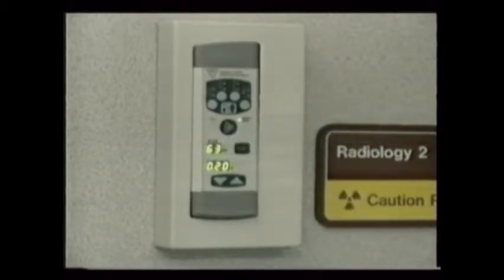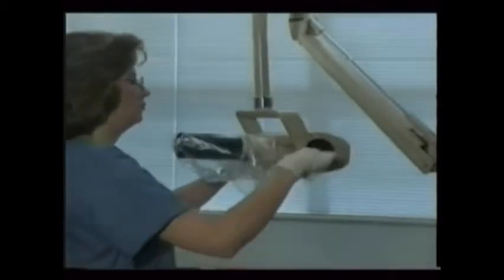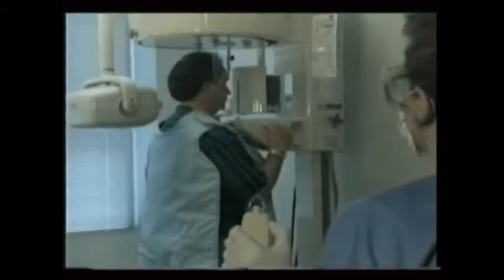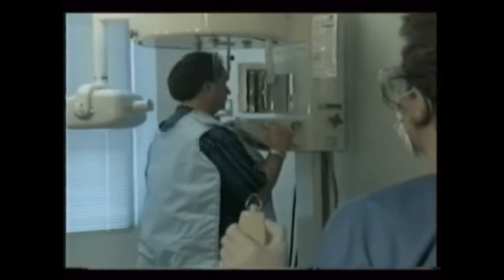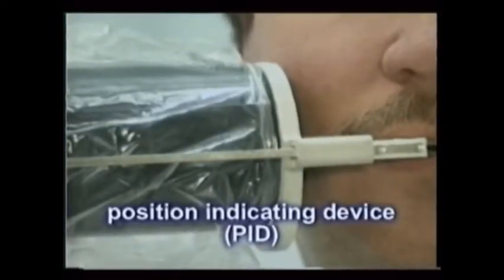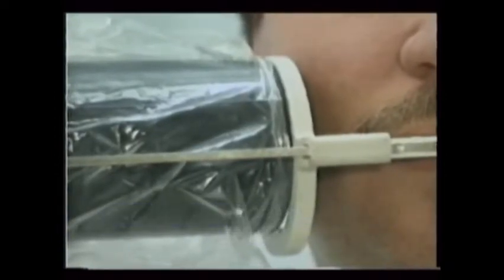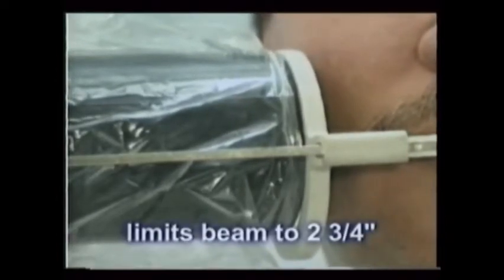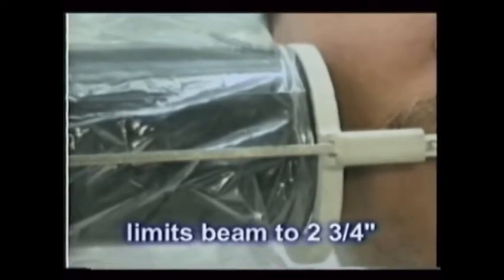The X-ray machine consists of a control panel and the tube head. Intraoral machine tube heads are widely movable. A panoral machine's tube head moves in a circular arc around the patient's head. The tube head has an aluminum lead-lined tubular positioning device, sometimes incorrectly called a cone, that shields out the weak scatter radiation. It restricts the useful 2 3/4 inch beam of the intraoral X-rays to the film.